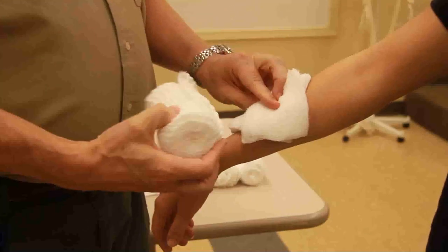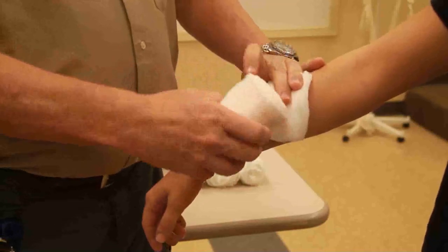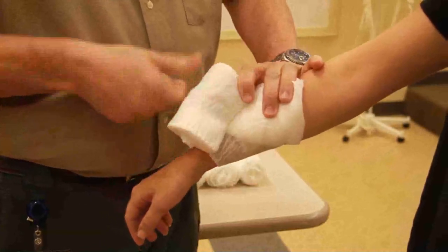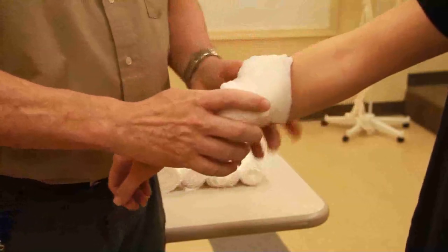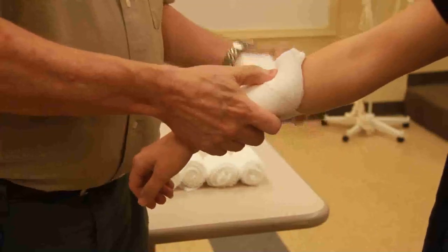Now remember, once you put this on, you shouldn't be looking at it anymore. I'm going to put an anchor wrap on — an anchor wrap is really just to keep my bandage from slipping all over the place — and now I'm going to, again keeping direct pressure over the top.